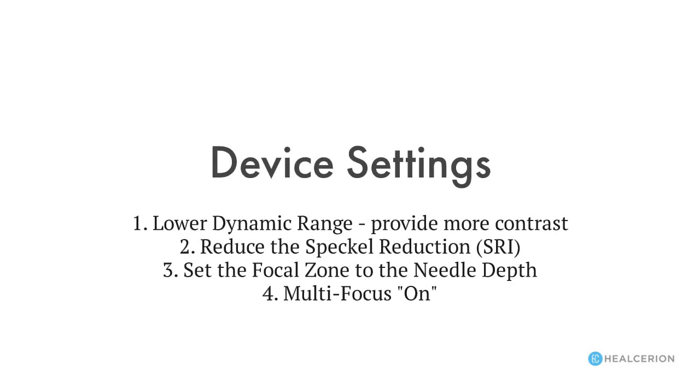On your ultrasound device, a few settings may help. First, lower the dynamic range, which will produce a little more contrast. You can also try reducing the speckle reduction and set the focal zone to the needle depth. And sometimes putting the multi-focus to the on position will help.